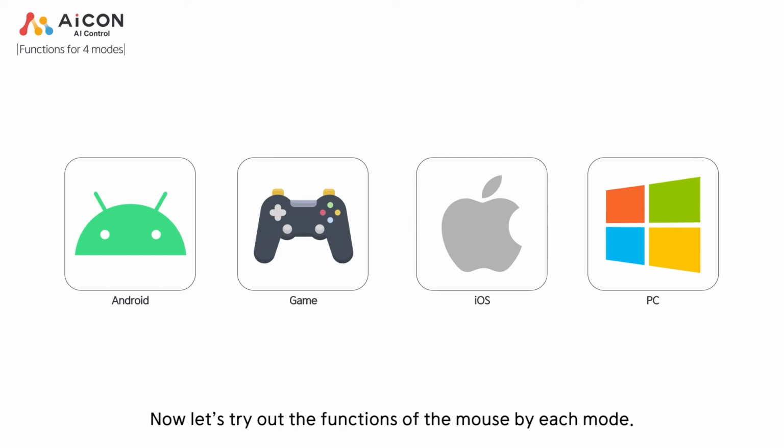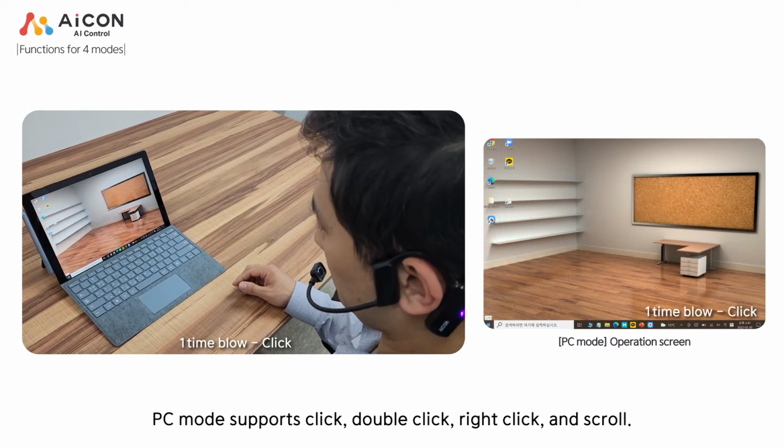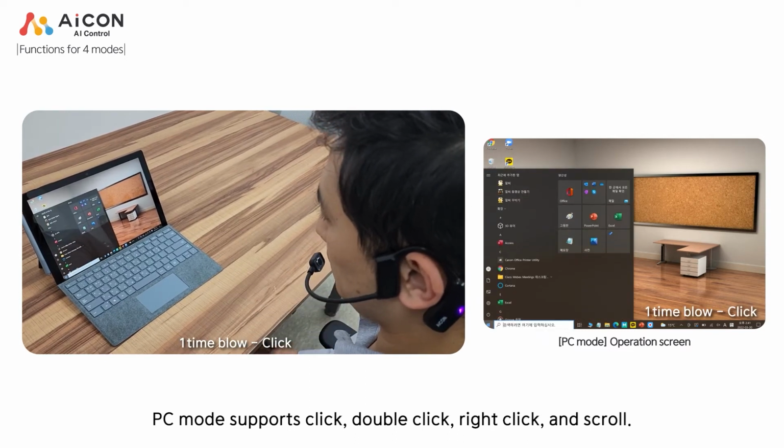Now let's try out the functions of the mouse by each mode. PC mode supports click, double-click, right-click, and scroll.